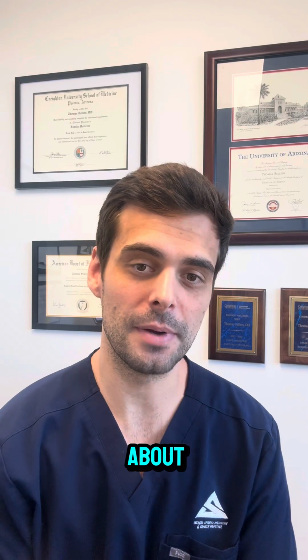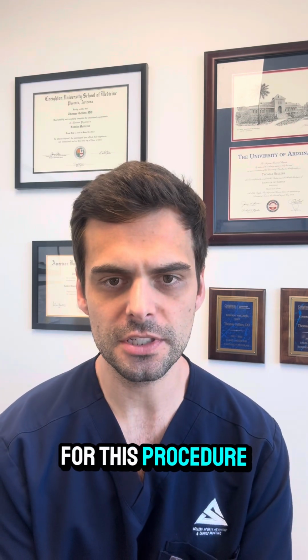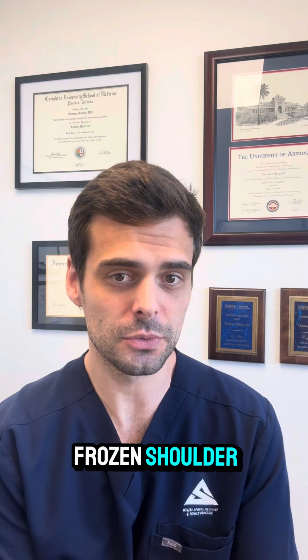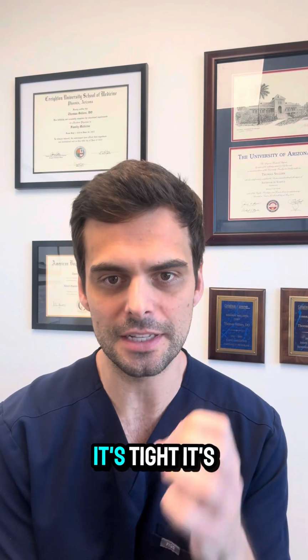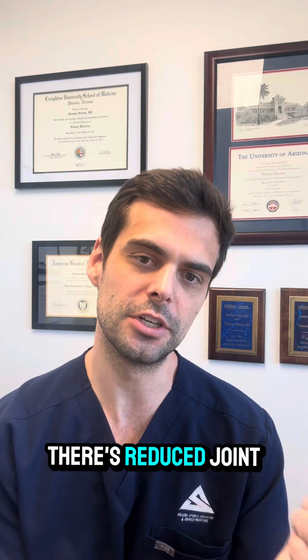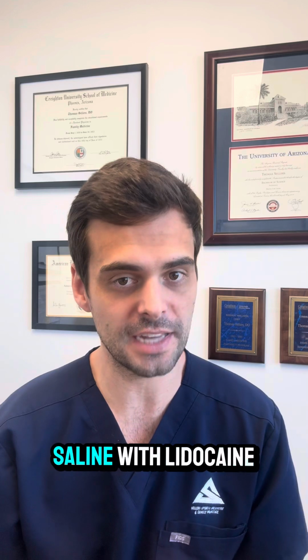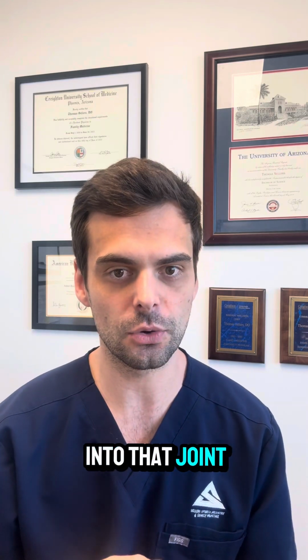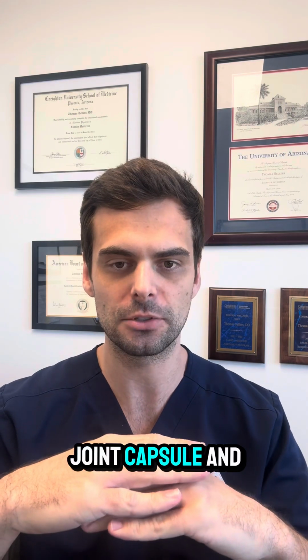Now let's talk about the shoulder hydrodilatation procedure. For this procedure, the problem with frozen shoulder, really, one of the main problems is that we have a thickened joint capsule. It's tight, it's sticky, there's reduced joint volume, so we're trying to reverse that. We're doing a high volume saline with lidocaine into that joint under a firm amount of pressure to expand that joint capsule and lift it.